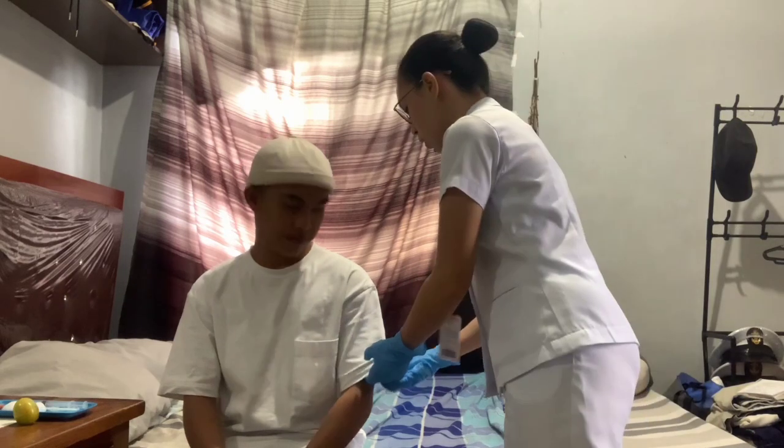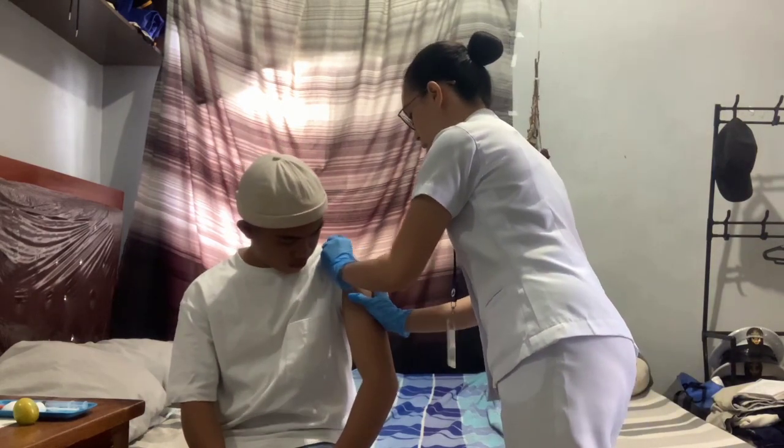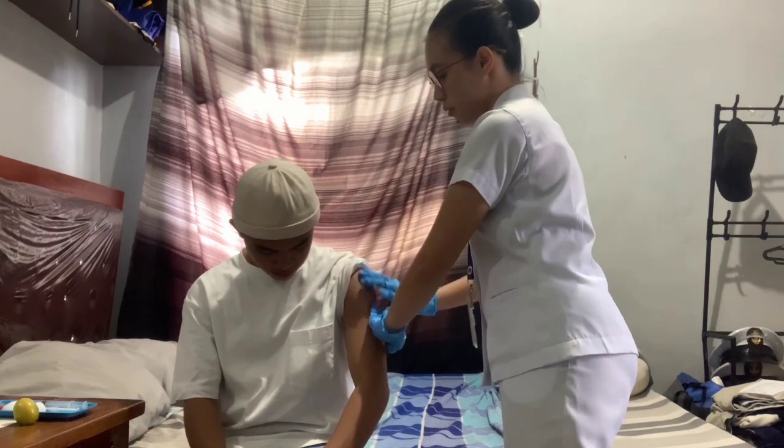So now we are done with our intradermal route. We are now going to proceed in doing the intramuscular route. So now I'm going to select, locate, and clean the site using the antiseptic swab. So sir, let me just lift up your sleeve so that we are going to expose the deltoid muscle.